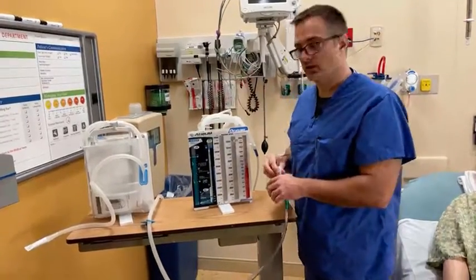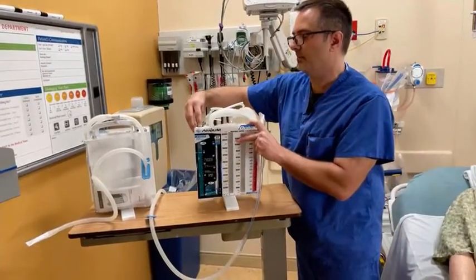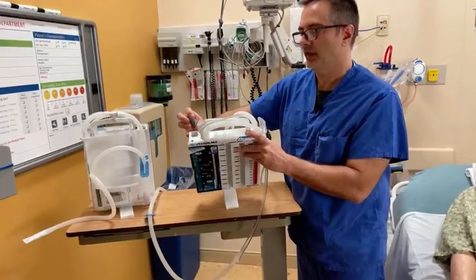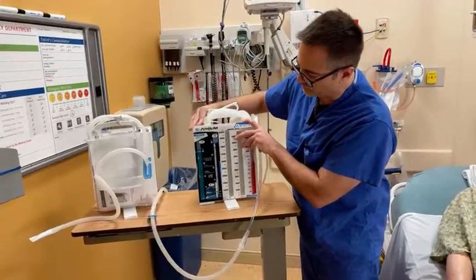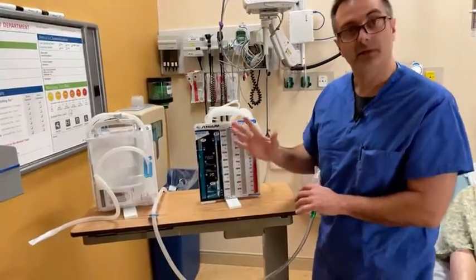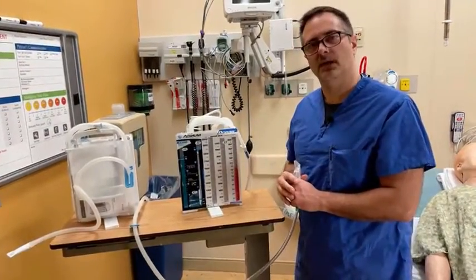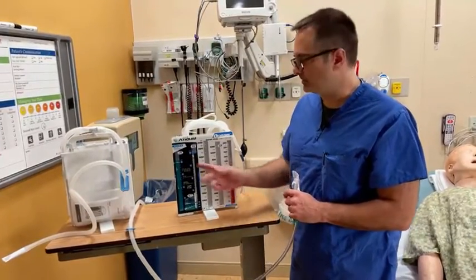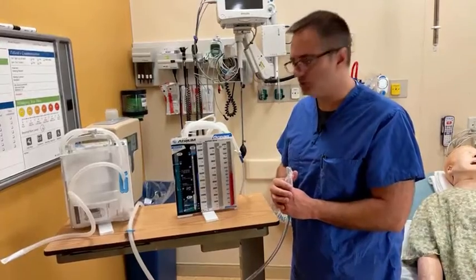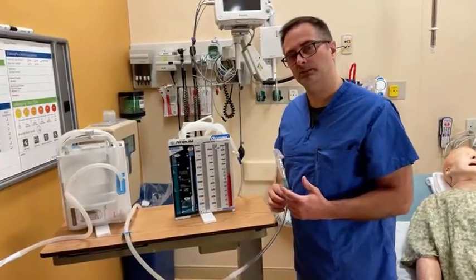So next, with the suction control chamber, there is a fenestrated plug on the top, which I'll remove here, and that is where you're going to pour in your sterile water. Once again, as we talked about, you're going to fill to the 20 centimeter mark, and then that's it. Periodically, if the patient has the chest drain for a long period of time, you may need to add additional fluid in there, so you want to periodically check to see how much actual water is in the suction control chamber. But now that we have that hooked up, we're ready to connect to our patient.